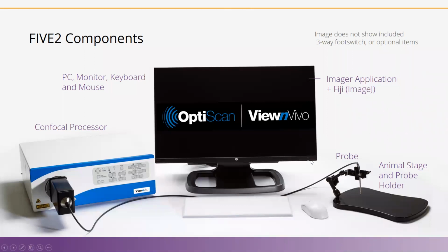So this entire instrument is a very simple miniaturized instrument. You have a confocal processor where the entire confocal technology is miniaturized. It generates the laser power, and the laser power is pumped into this probe. And from that probe, it goes to the animal. On the animal stage, you have the probe handler, which is basically a micro positioner. So you can micro-manipulate your probe's position on the animal. And here you can combine your anesthesia and other things. All the analysis computation is performed on this computer. This computer will keep track of your imaging and perform all the analysis you want.